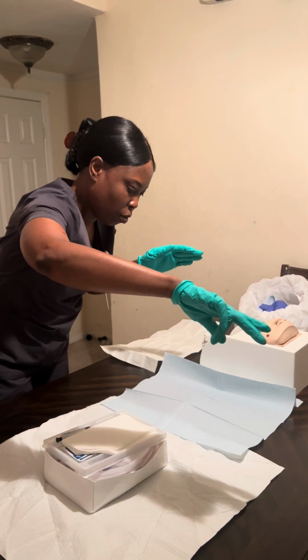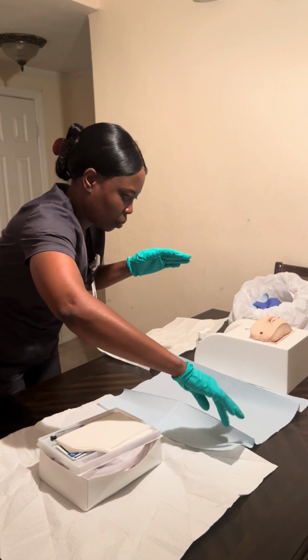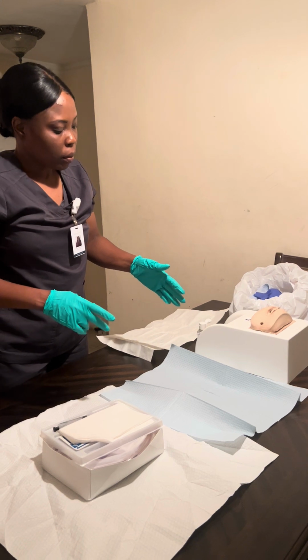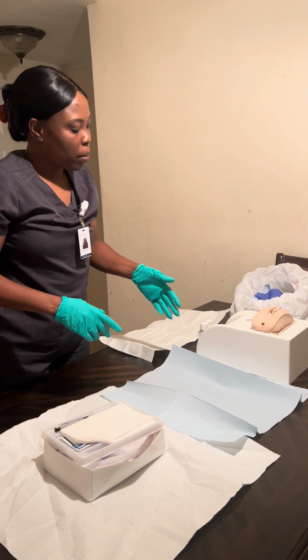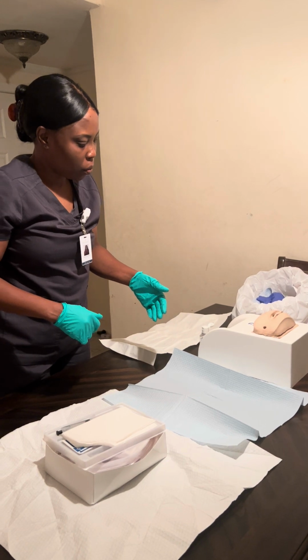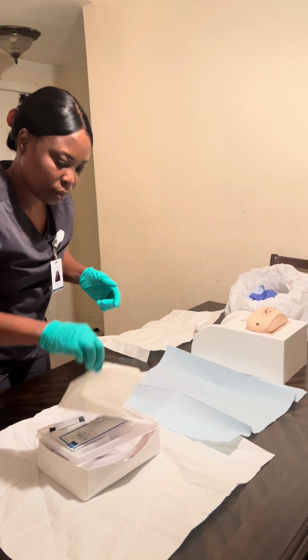I'm gonna make sure to move it a little bit from here. Don't touch inside. I'm gonna put it on the bottom. Mrs. Smith, can you lift your hips up for me? Okay, thank you. I'm gonna take the other tray.